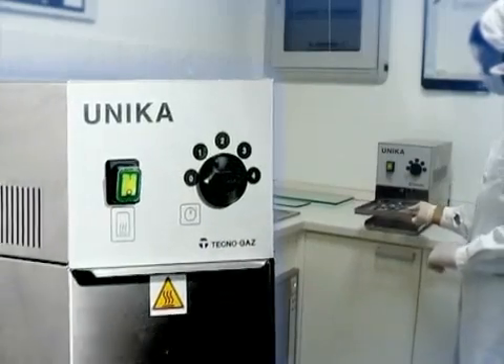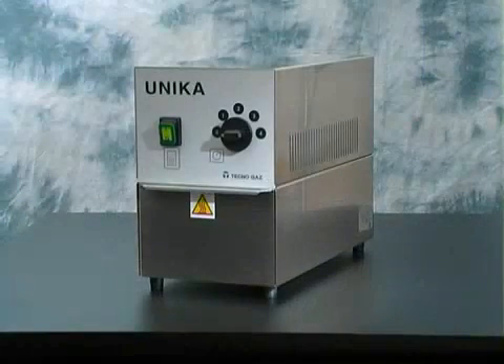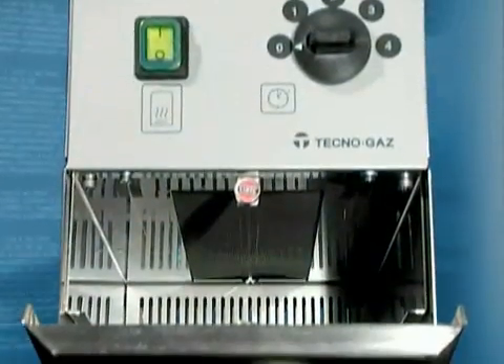Technogaz has created the Unica, an exclusive device especially designed to guarantee perfect drying. Unica is entirely made of stainless steel and is simple, practical and quick to use.